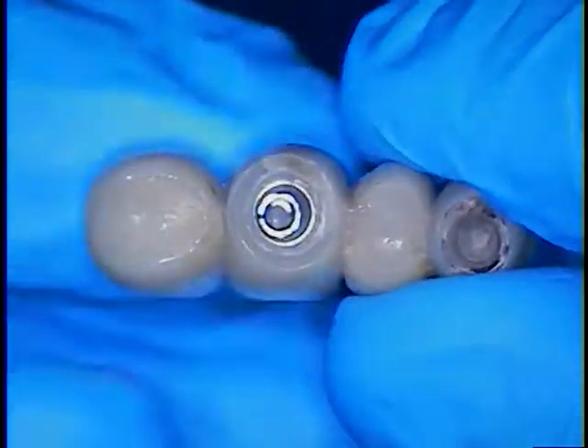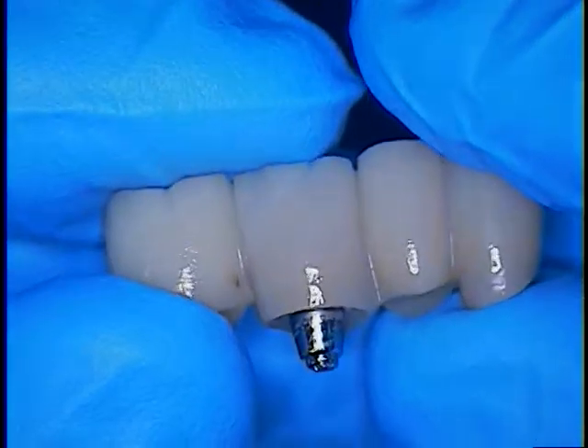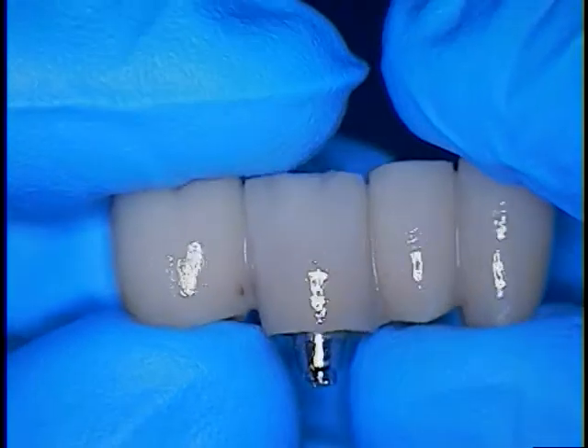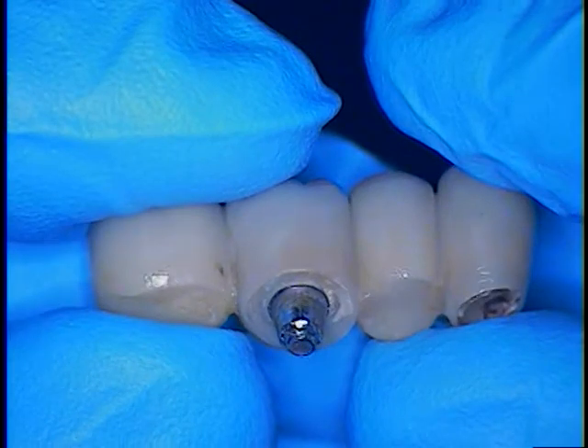This is Dr. Jerry Como. I'm here with an implant rescue case. This one is a Straumann TL case with a distal abutment that is a wide neck in the tooth number 30 position that has been fractured.